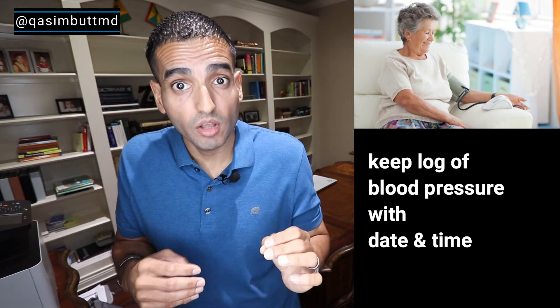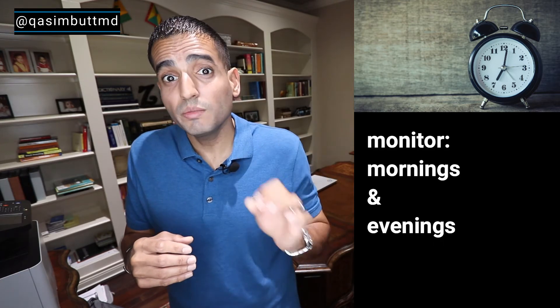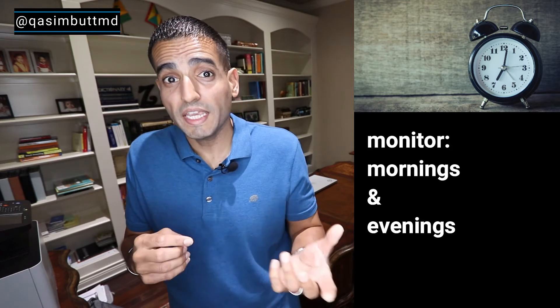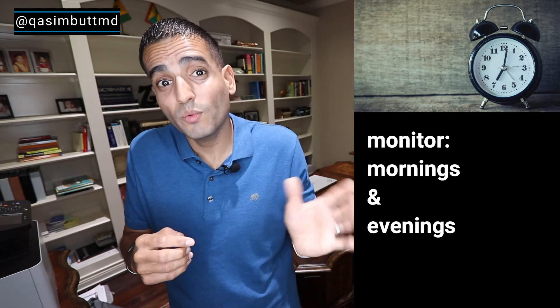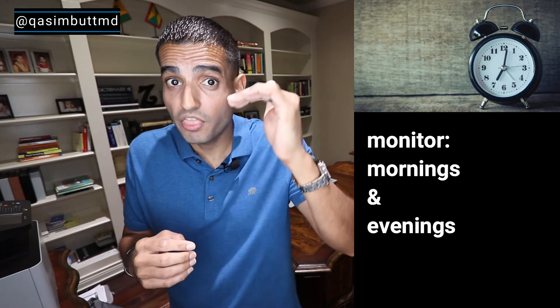You need to keep an accurate log. As far as timing, you should take it twice a day — once in the morning, once in the evening. You need to be consistent with your times, so if you take it at 10 a.m. on one day, you should take it around 10 a.m. on other days, as blood pressure tends to fluctuate throughout the day.